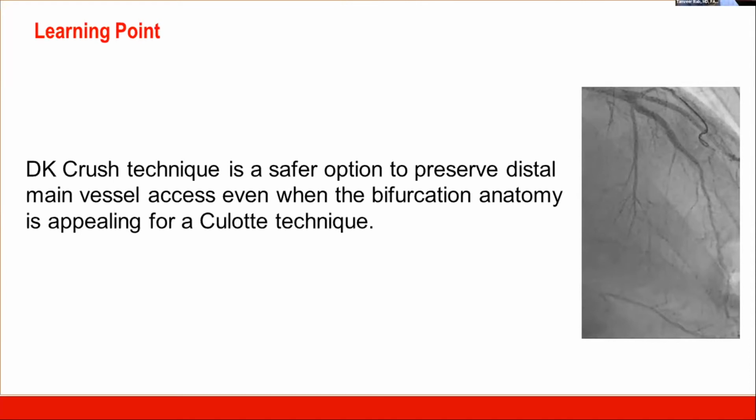I think you need to have enough length to take at least an 8 millimeter long balloon. You really need to size it to the proximal segment and go right up to the carina, sizing 1-to-1 on the proximal segment to crush the struts right up to the carina. So it has to be a large balloon to the proximal segment, at least 8 millimeters in length. So at least you have to have that much stent segment above the carina to be able to do that.